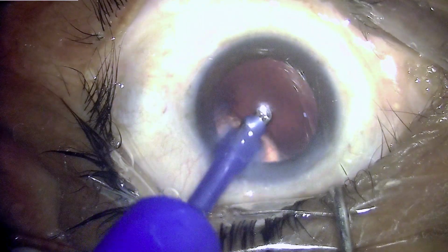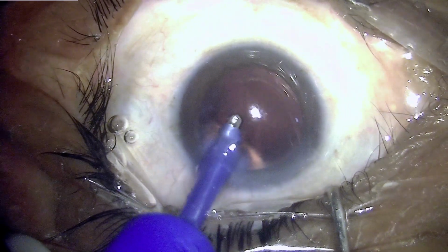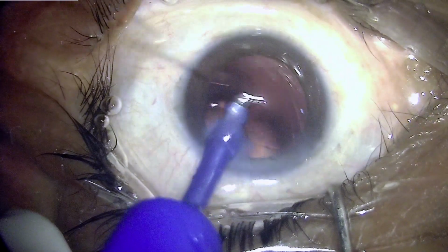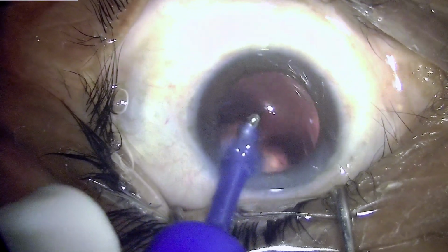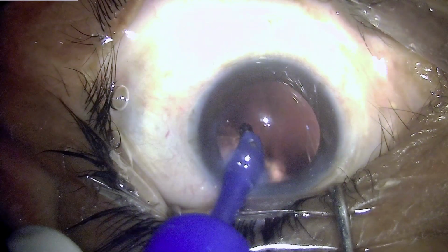However, in this given situation, the vitreous has behaved pretty well. Until now, the vitreous has not yet prolapsed into the anterior chamber, and that is something which is very consoling and makes the surgery less eventful, with fewer complications.